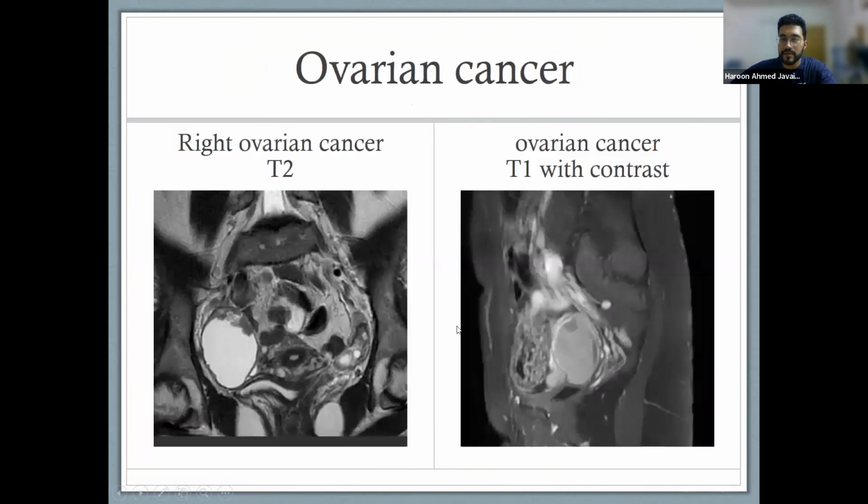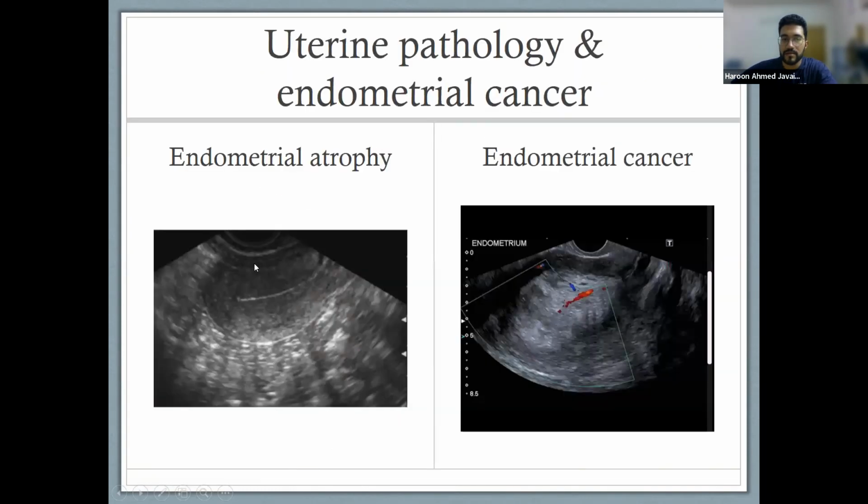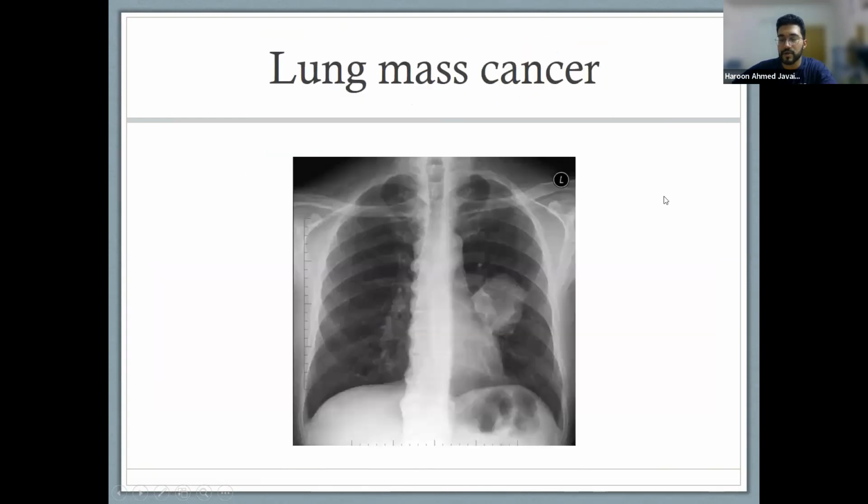Basically, you should be able to know if this is a normal uterus, or if there is some abnormality. If you see this, this is definitely abnormal. I don't think they'll bring you this, honestly. I don't think they'll bring you this either. This they may bring you and mention to you, this is the uterus, if you see something like this, which is clearly abnormal, you would know that it's probably cancer. So over here, I think it's just pattern recognition of images that you have to do.